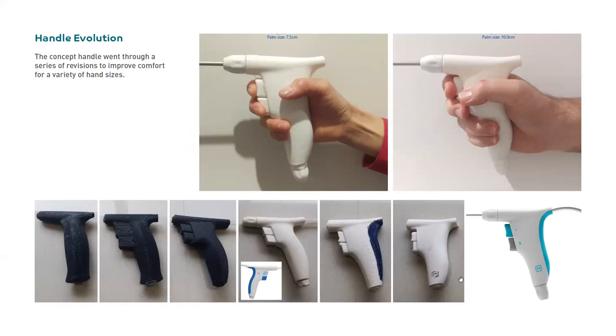And one of the things we had to address was that these buttons are really close together in our early prototype. So if you have fingers like this person here, you could not physically press that top button without activating the other one. And I'm really glad that we looked at all these different hand sizes to get it right. So we had these notches in the middle to separate them, and we saw that hands were slipping off, so we had a notch at the bottom, which is what we've ended up with here.